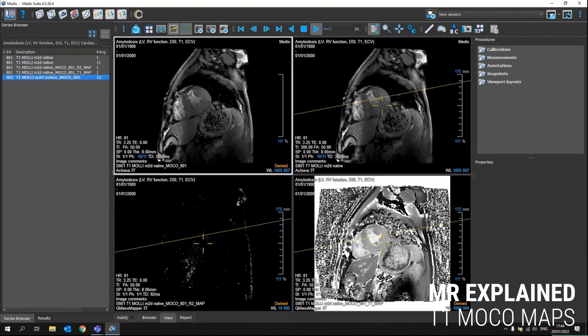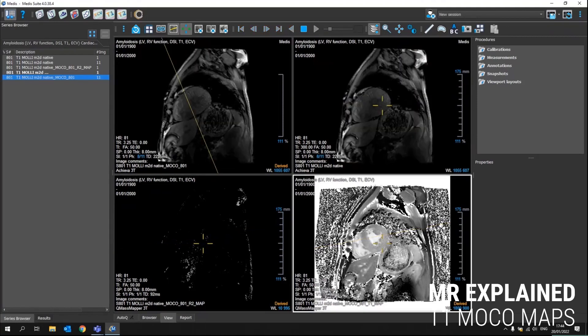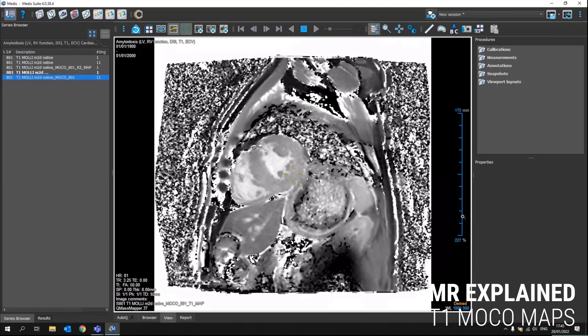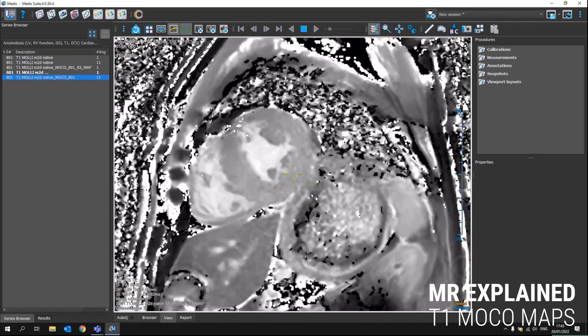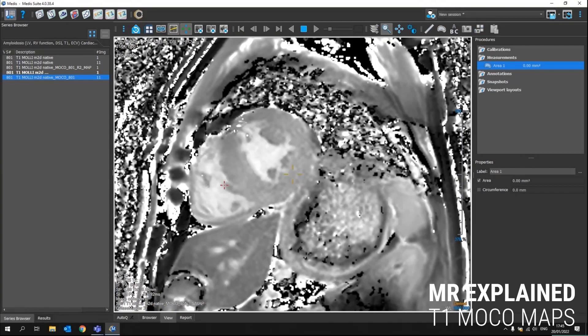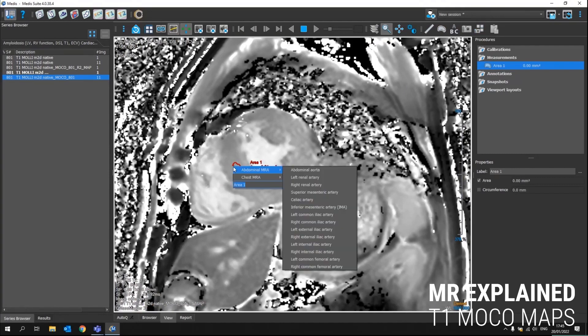Now in this T1 map, when we double click, we get a larger view. We can also even zoom in more. Since these pixels all have a T1 value, if we make an area measurement in here or select the area measurement, let's call it just area one.